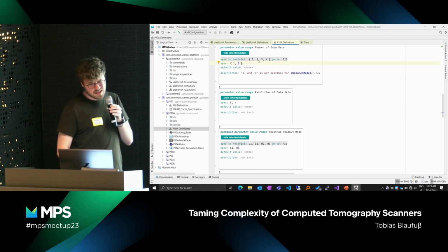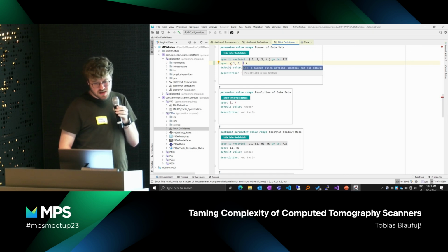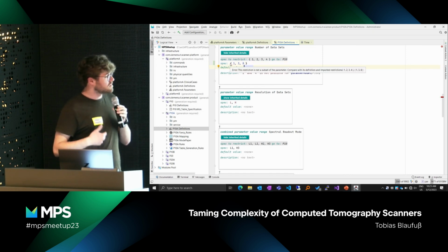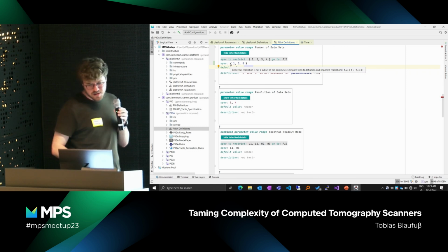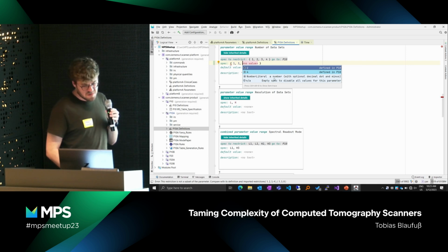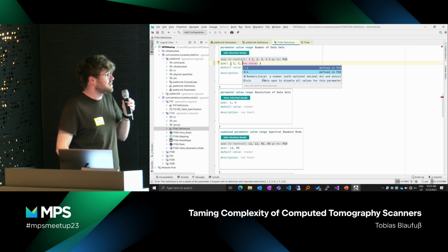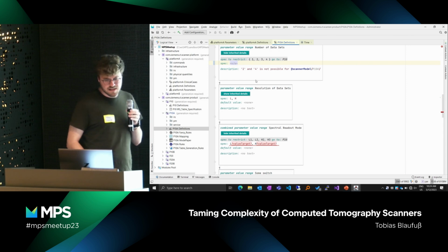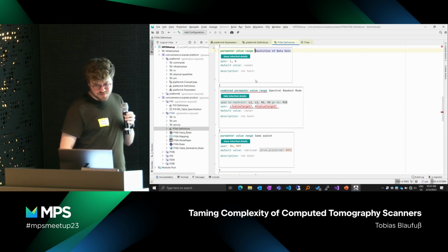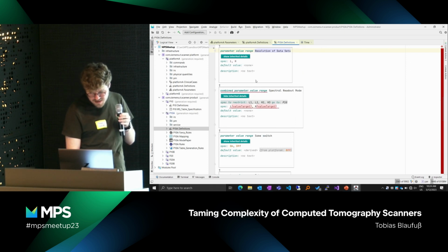Sometimes there are also, say, 20 possible values here, and then you obviously can type in this value. And as you see, 8 is not possible according to our restriction hierarchy. So you can type it in manually, or you can open up this completion menu, where it's colored what is actually possible if you want to define something new. Okay, you can also just deactivate it, but as you see, this would have some other implications here.